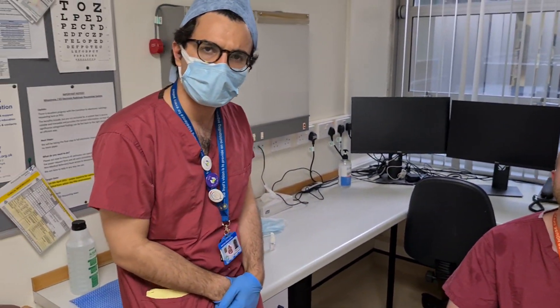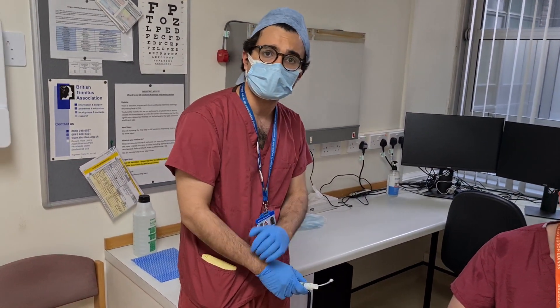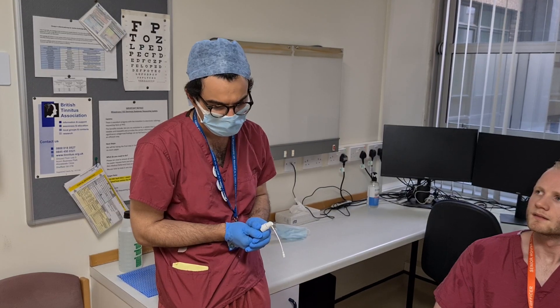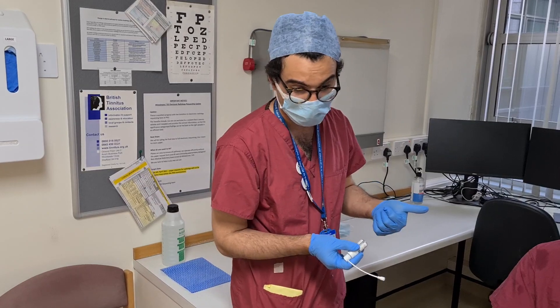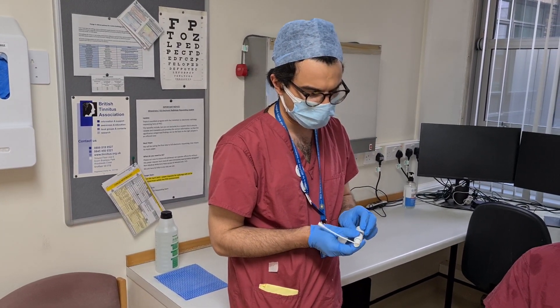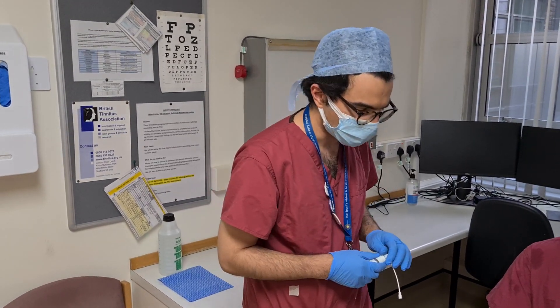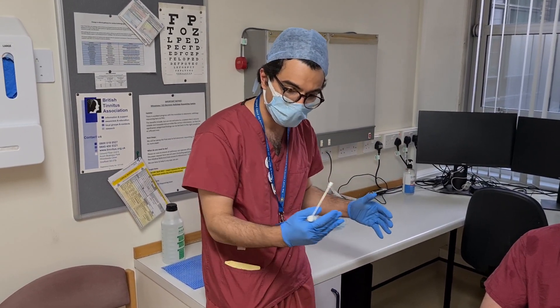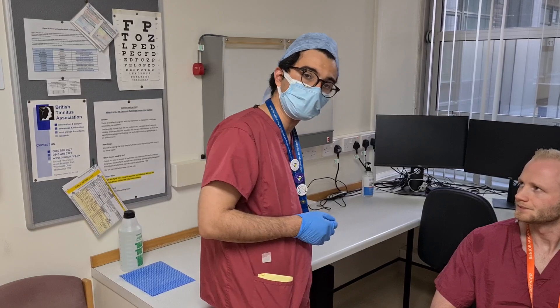In every patient when you're performing a flexible nasoendoscopy, you should always ask them whether they would like to have the local anaesthetic. We tend to use the combination of phenylephrine and lidocaine. The two aspects of this are: first, the local anaesthetic makes the procedure a little bit more tolerable for the patient; and the phenylephrine acts as a decongestant, making the first part of the procedure — going through the nose — a little bit easier, as the tissue is slightly reduced in size.